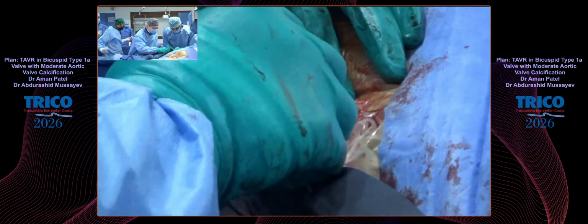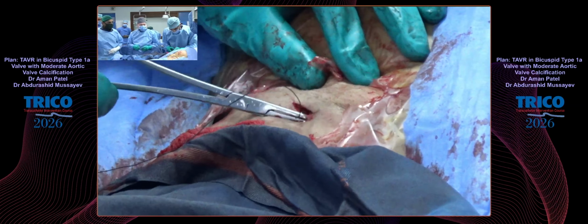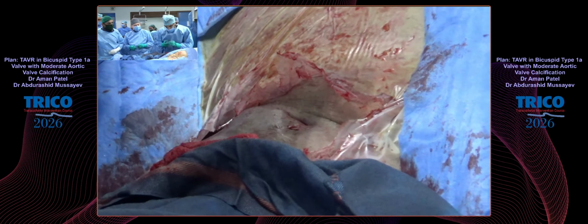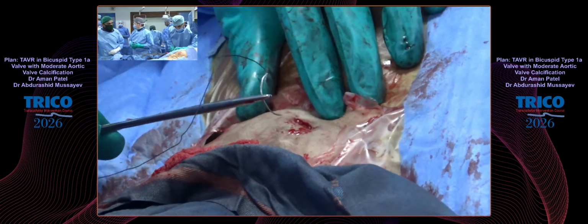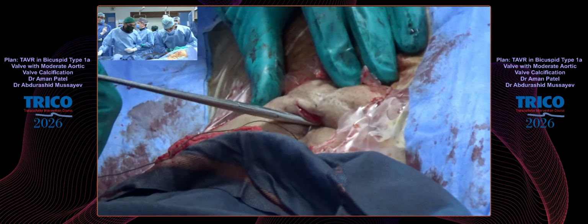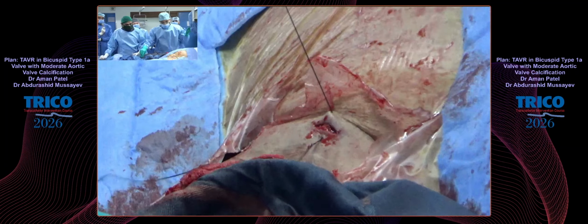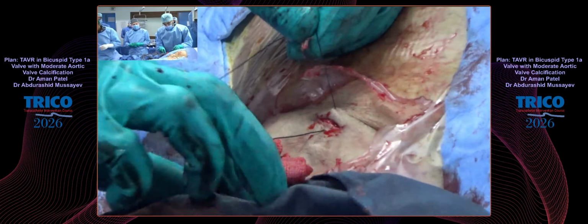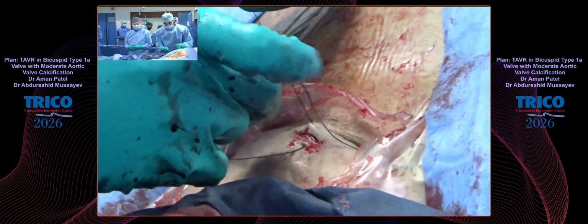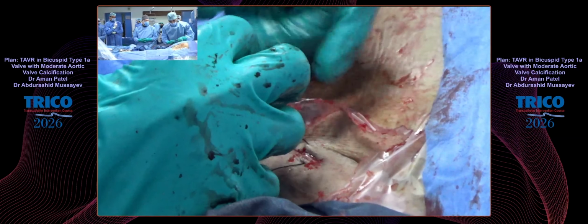Is it a routine practice to take a stitch like this? Because we don't do this. Just to fix the skin, and that's all. We generally do not take the stitch. I personally like to keep this open because if there is going to be any rebleed, I want to have it come out and see it rather than collecting a hematoma inside. If there was oozing, we generally use a cocktail of Lido and Epi and just inject subcutaneously. But this looks like a perfect closure. There is no oozing or bleeding at all.